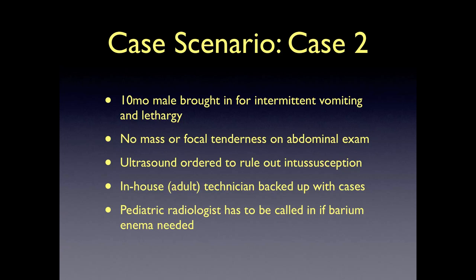In each case, performance of an ultrasound at the bedside by the emergency physician would facilitate a timely diagnosis and disposition of the patient. And I'll show you how it fits into a decision algorithm later on during the talk.